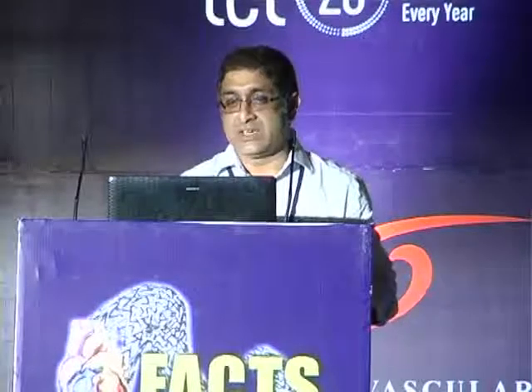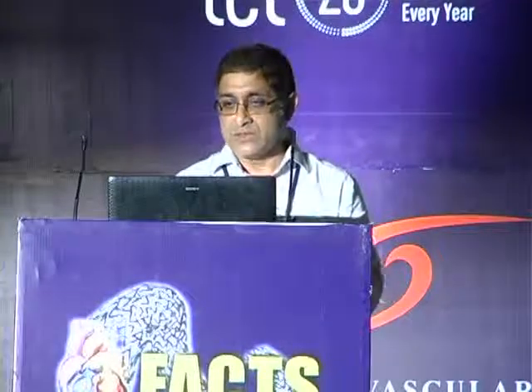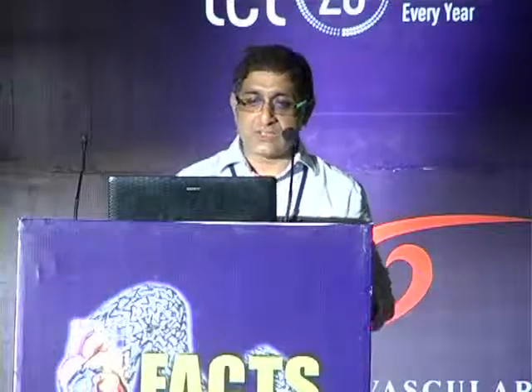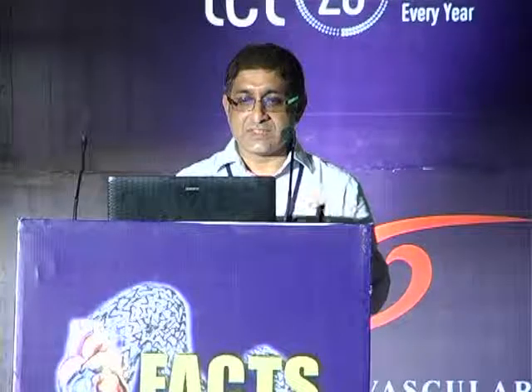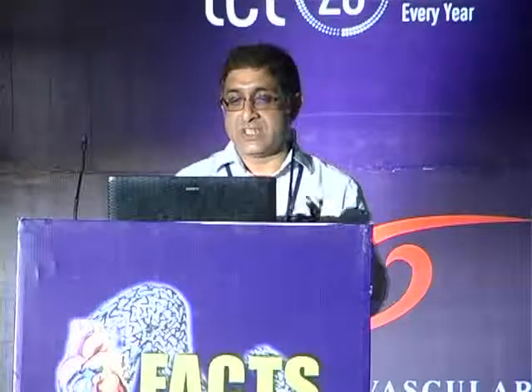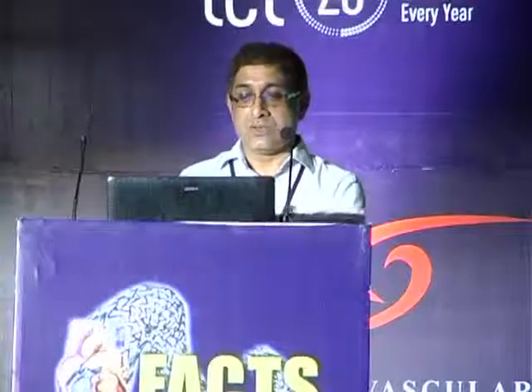So my top 5 tips are: assess aortic root takeoff in the beginning by doing the root angiogram through the guide catheter oriented either towards the LCA or RCA, upsize or downsize or choose a different shape as required. Often the circumflex, or less frequently the LAD takeoff from the LMS, is at an awkward angle. Pass a second wire distally in the less angulated vessel to stabilize your guide catheter. If during the course of balloon exchange, the guide catheter backs out inadvertently and there is a loop formation of the guide wire in the aorta, re-engage the guide catheter by first passing a small balloon over the wire loop into the coronary ostium and follow the balloon, instead of trying to re-engage the catheter just over the guide wire.